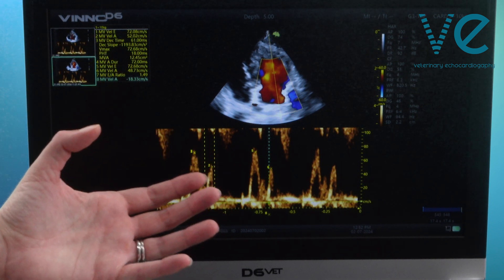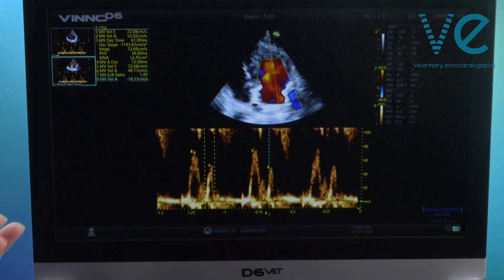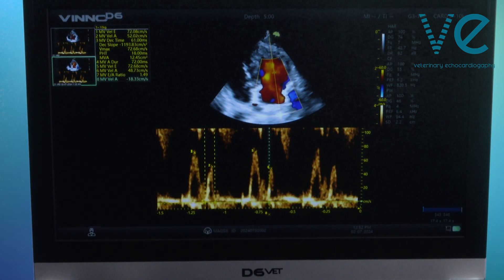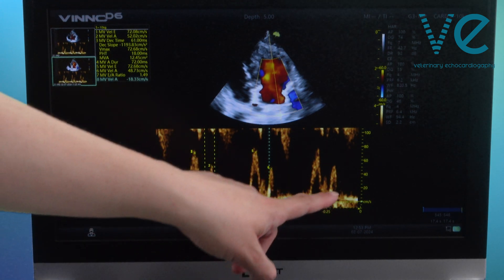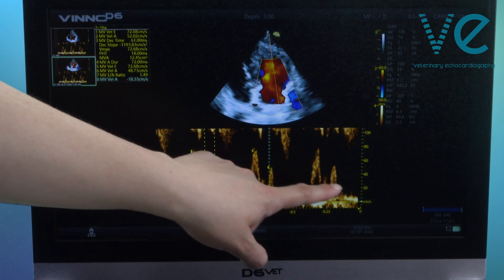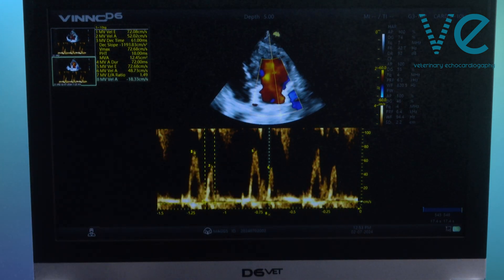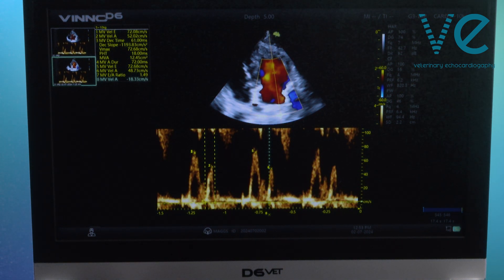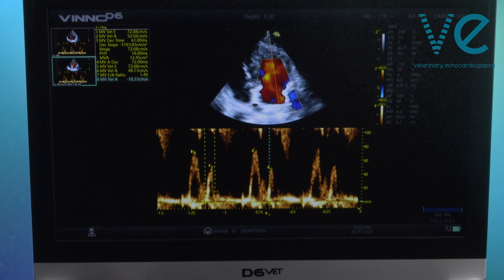But in this particular cat, everything looked normal and the mitral inflow pattern also looks normal. If this cat's A wave had been higher than her E wave, well then that would be a sign that this cat probably has diastolic dysfunction, and I would definitely want to be taking other measures at that point.